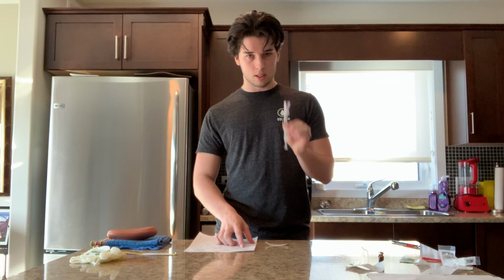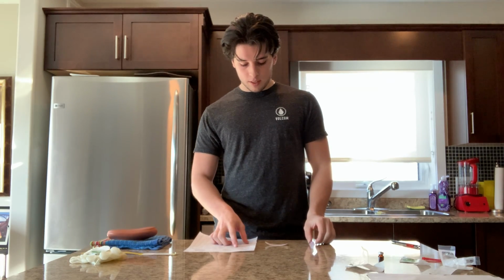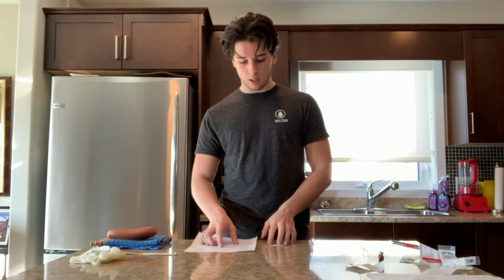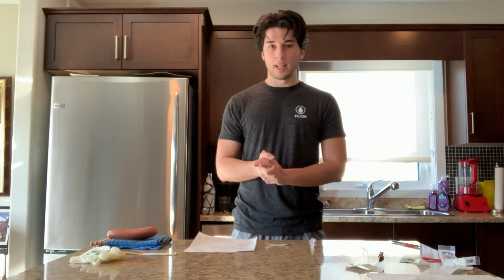We have our subcutaneous injection needle ready to go. It is to be given daily at 0800, and it's 0825 right now, so we are good to give this medication. And now that our third check is done, I'm going to educate the patient a little bit.